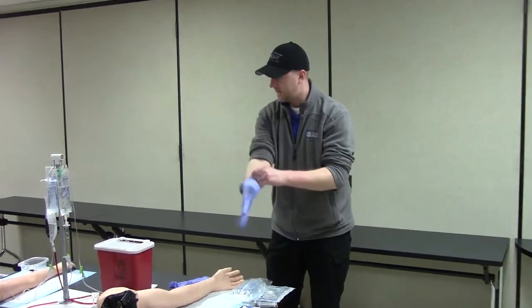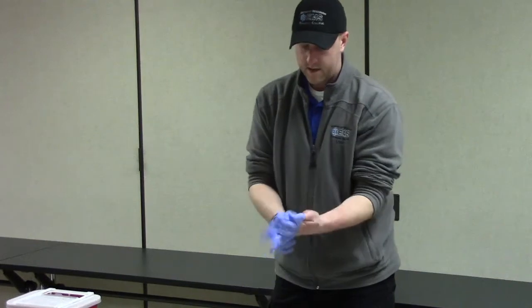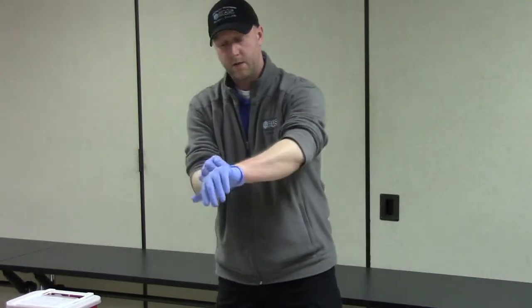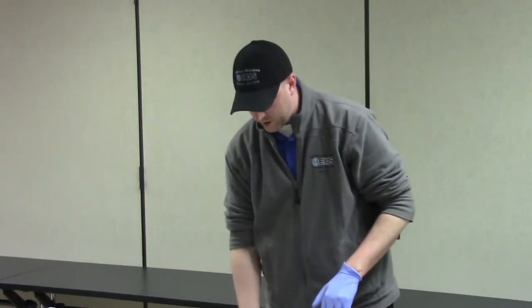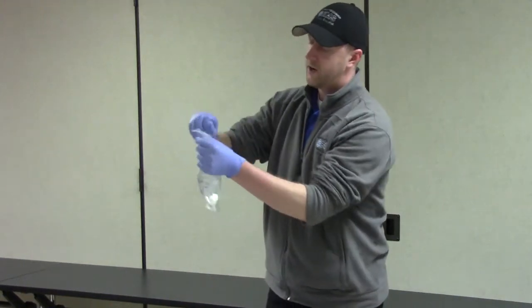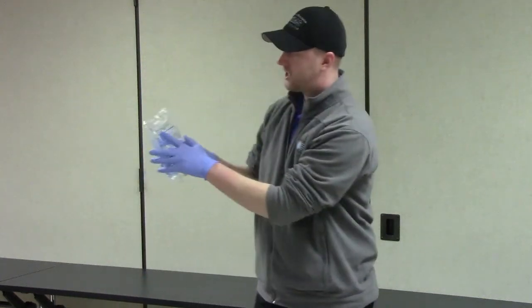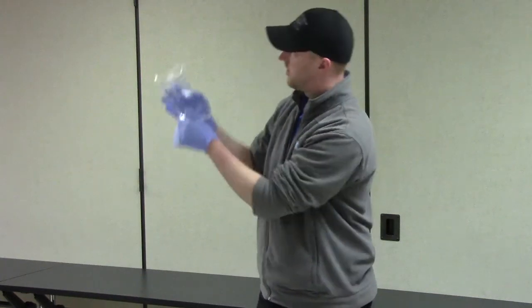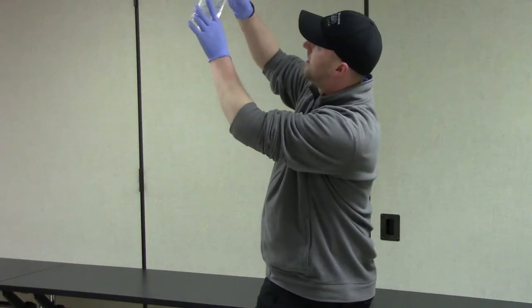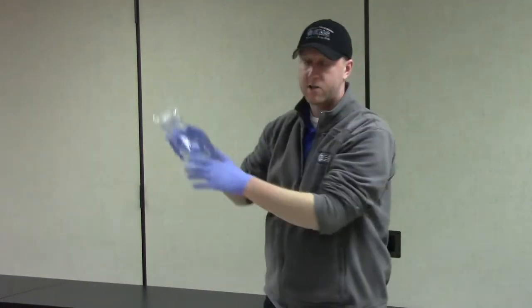Let's get started. I'm going to go ahead and put my BSI on right away. Once our BSI is on, we're going to set up our fluid and make sure it's ready to go. I'm going to grab my normal saline and open it up. I'm going to make sure that I have the right fluid, make sure that it's clear, it doesn't have anything floating in it, and last but not least, that it's not expired.